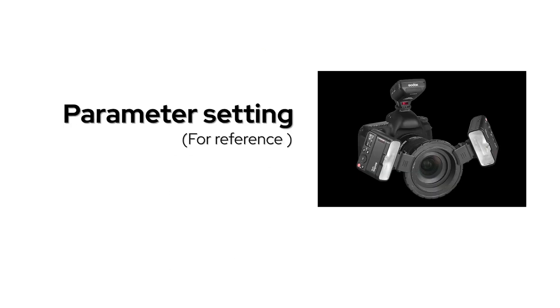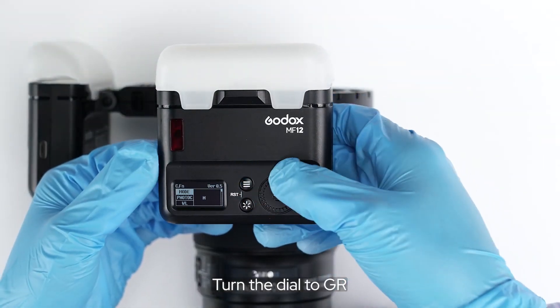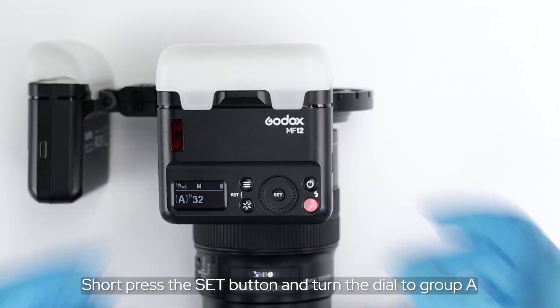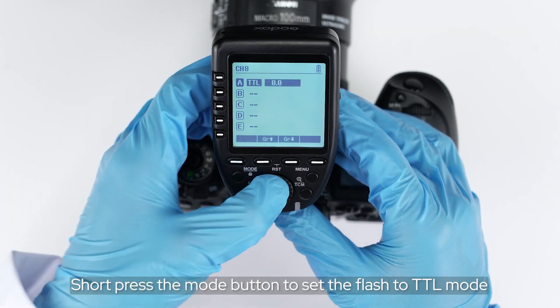Parameter setting: Set the two flashes to group A. Short press the menu button, then turn the dial to GR. Short press the set button and turn the dial to group A. Short press the move button to set the flash to TTL mode.